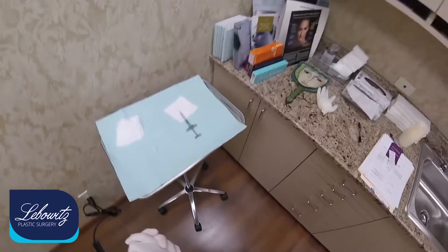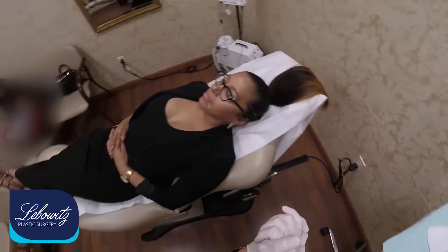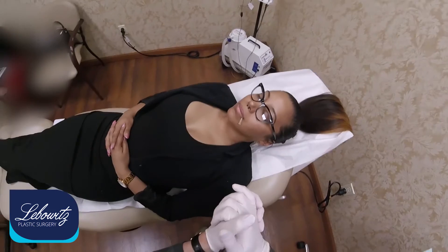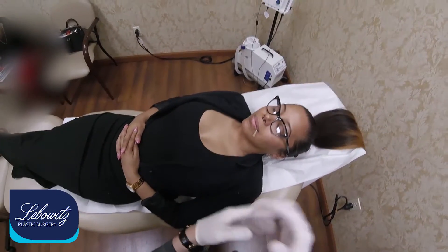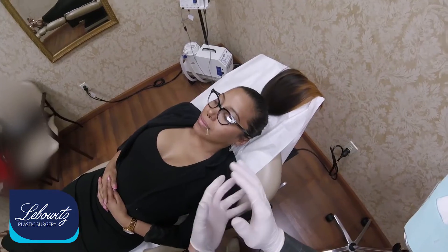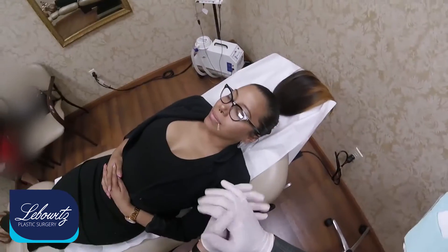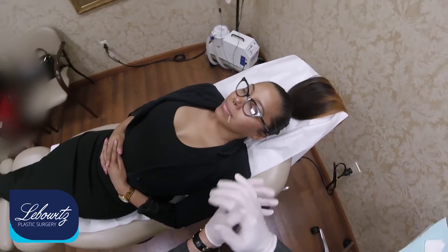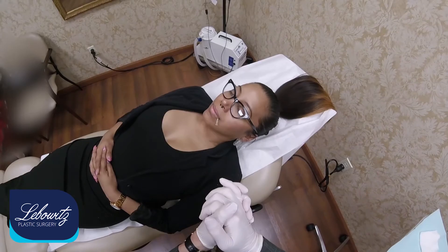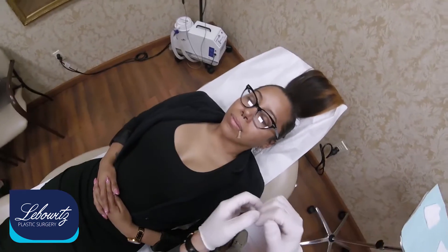The product I'm using is Juvederm Smile. It's a Juvederm product — it's an HA, hyaluronic acid, a natural gel that the body produces which retains hydration of the lips. Juvederm Smile is specifically formulated for the lips and gives a very natural, soft, subtle appearance — not hard, no lumps, no bumps. And with my blunt cannula technique, the results are extraordinary.